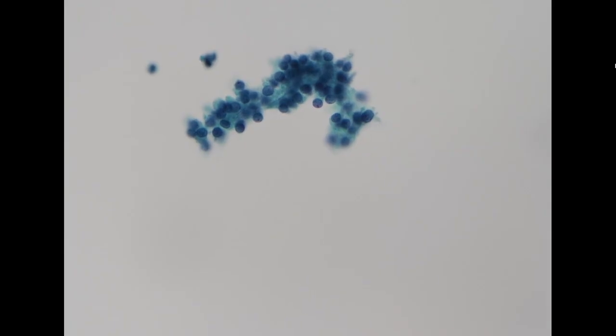And if we only have a very scant cellular component such as this one, but the background doesn't look like a hyperplastic nodule because there's no colloid, and the arrangement is predominantly microfollicular, we would call these AUS with architecture atypia.